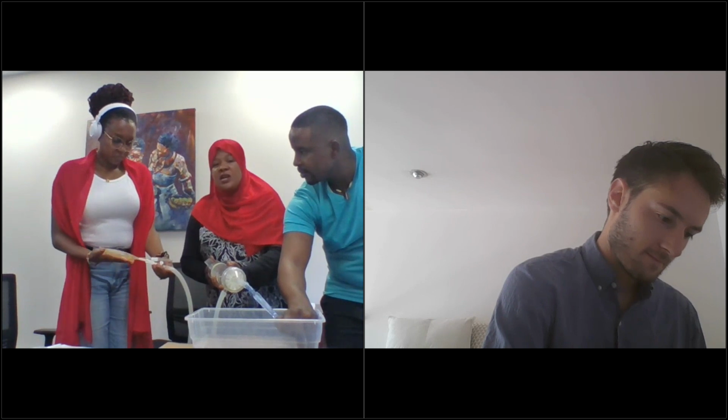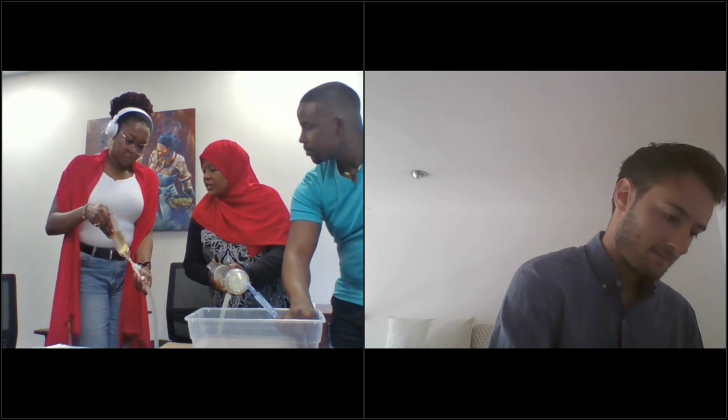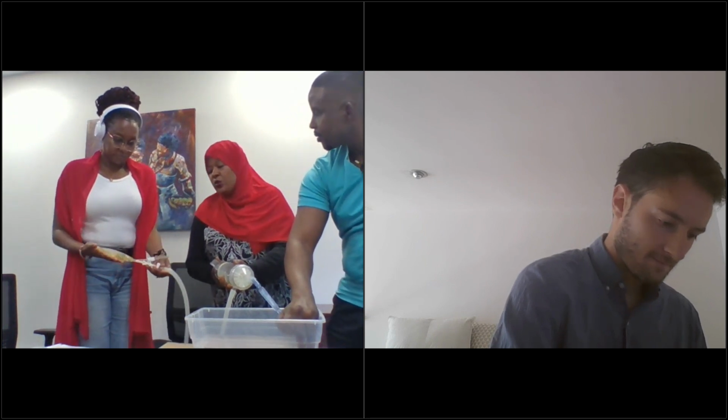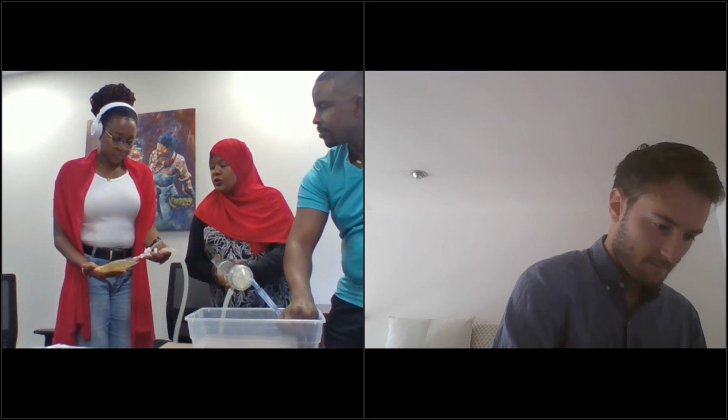So, yeah, slightly. If I know the blood is moving in, just rock it. As she's rocking it, she will still be informing me how much is going into the blood bag, and from there I can either stop if, let's say, we are 3/4 full. Yes, we are 3/4 full. If she feels that the bag is full, she can tell me, oh, my bag is full, I want to change to another bag, and we can easily stop.